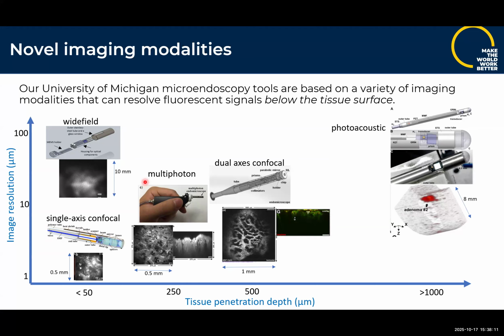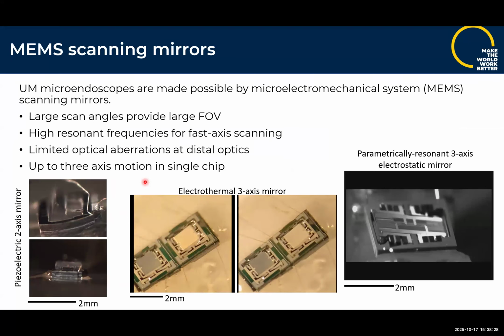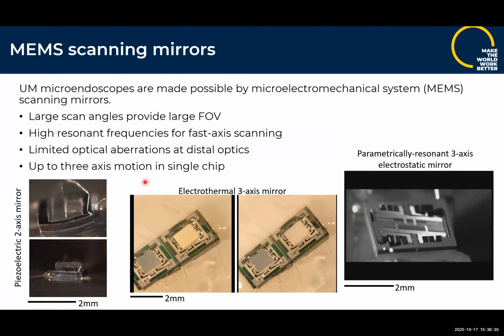And so the other thing that was kind of different about how we approach this is our use of microelectromechanical systems. And so micromechanical systems are really sort of my core area. Dynamics and control of these systems usually. If you aren't familiar with these, you can think of them as silicon chips with moving parts.